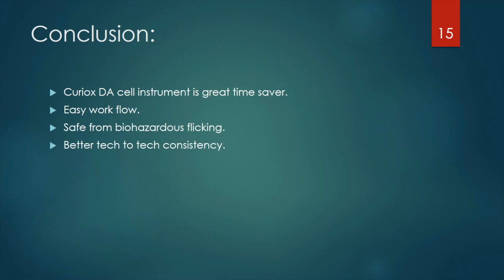If you have to take the residual volume off manually with a pipette, that will add tech-to-tech variability. So I would suggest optimizing your method so that you do not remove residual volume. And these plates are not made for centrifugation. If you're thinking that you could centrifuge and flick, these plates are not made for that. So avoid doing that, and I would suggest optimizing your method accordingly.